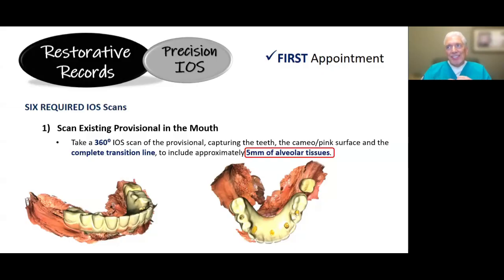When I say tight, we still want to make it cleansable for the patient, but we want to make things where the patient isn't having big gaps or being compressed, where their water pick isn't functioning well to get underneath it. So we want to see that transition line. A very important image to capture in your scan is this.